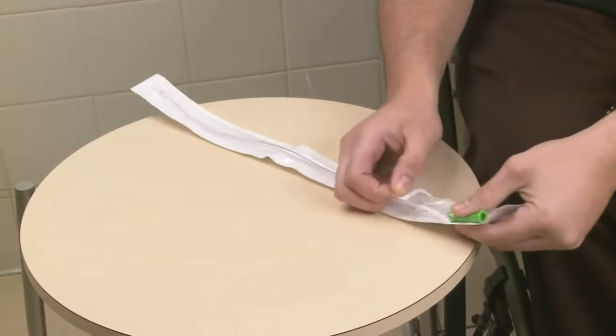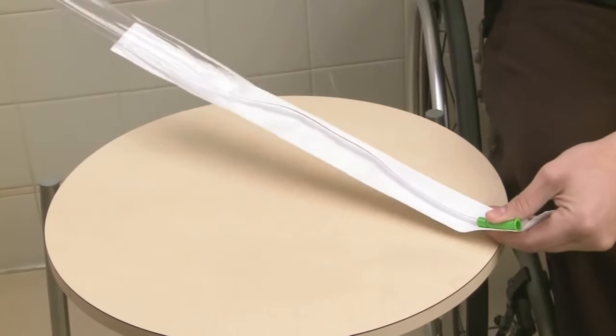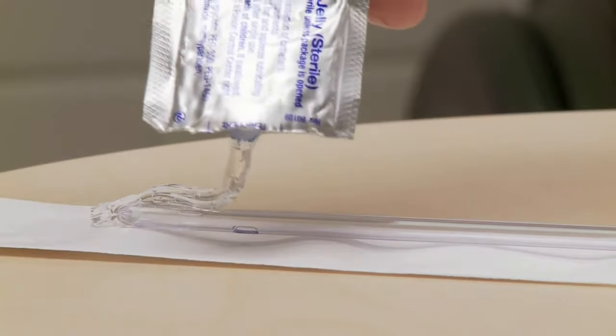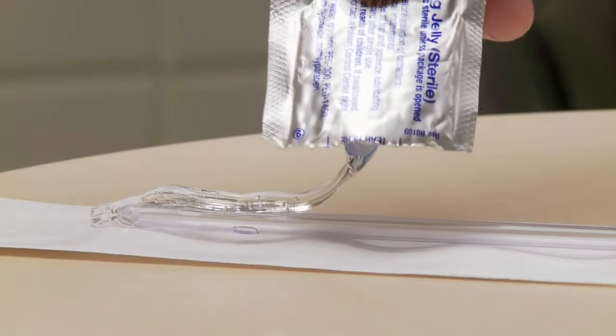Next, peel open the packaging for the Apogee Intermittent Catheter. Taking care not to contaminate the catheter, apply lubrication to the first few inches of the catheter.